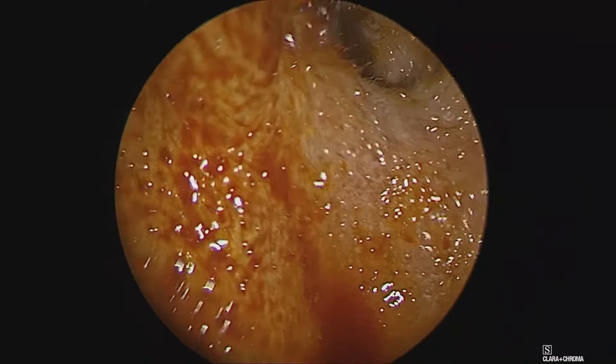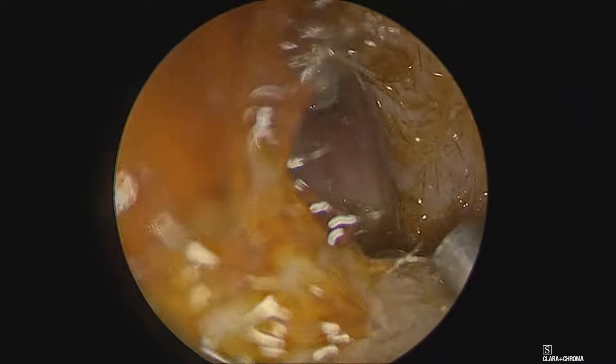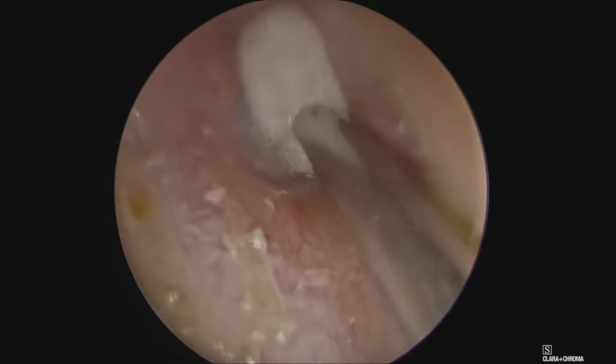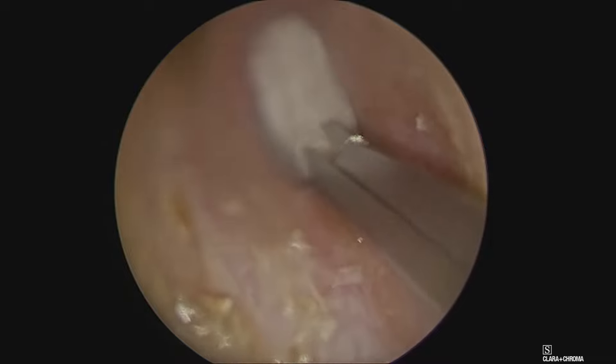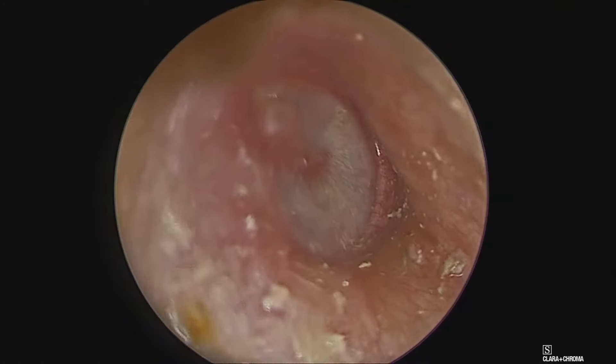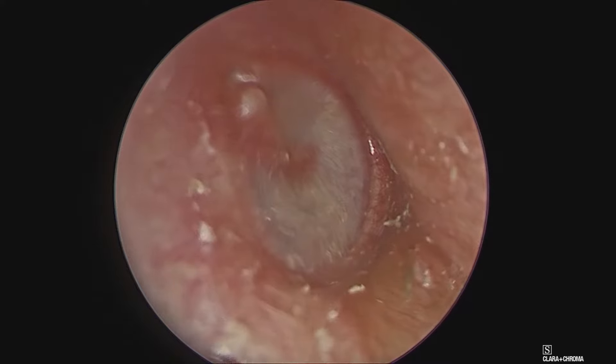Hello, I am Dr. Manish Gupta. The case we are showing here is an endoscopic myringotomy with grommet insertion. The part has been prepared with betadine and adrenaline-soaked cotton placed to achieve hemostasis, otherwise the incision bleeds too much in the tympanic membrane.